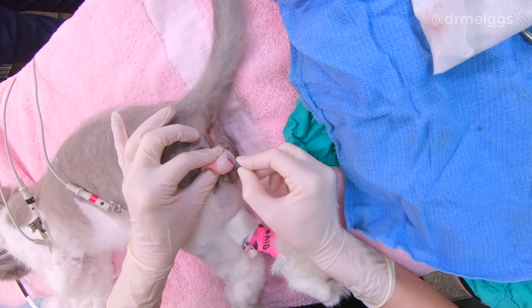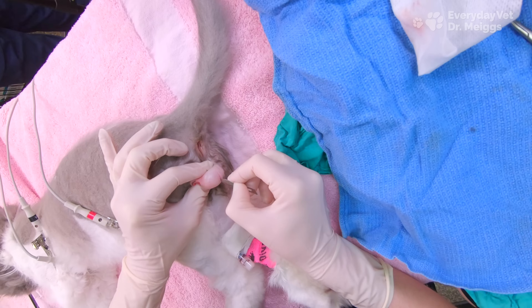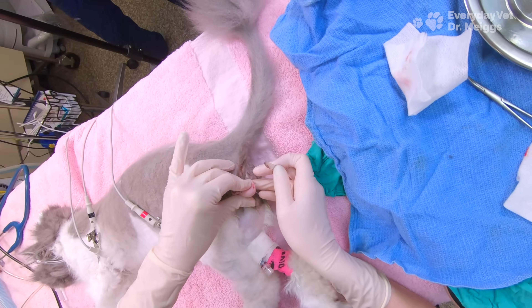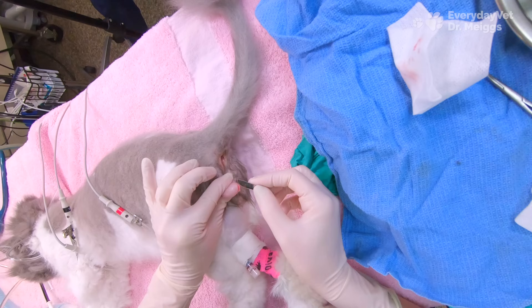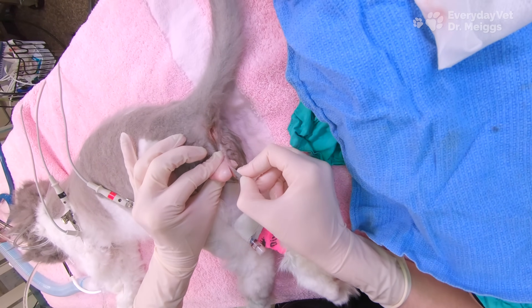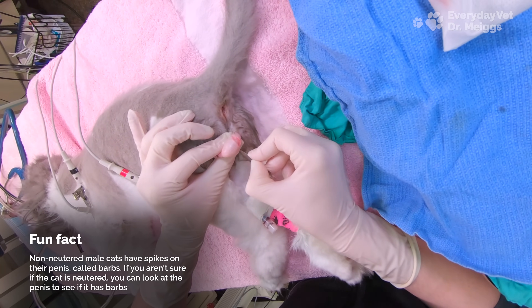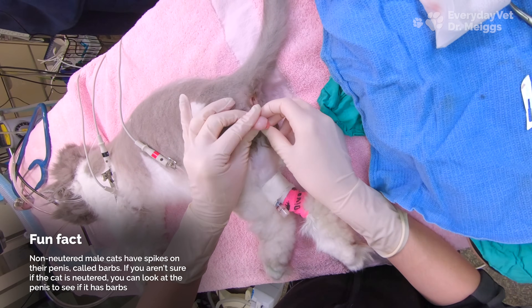Inside the scrotum is a tissue layer called the scrotal septum, which divides it into two separate compartments, so the left testicle is actually separated from the right testicle. Because of that I'm making a second incision to access the right testicle. I'm continuing to apply pressure underneath the testicle to push it up towards the skin layer, which allows me to make the smallest incision possible while still being able to exteriorize the testicle.